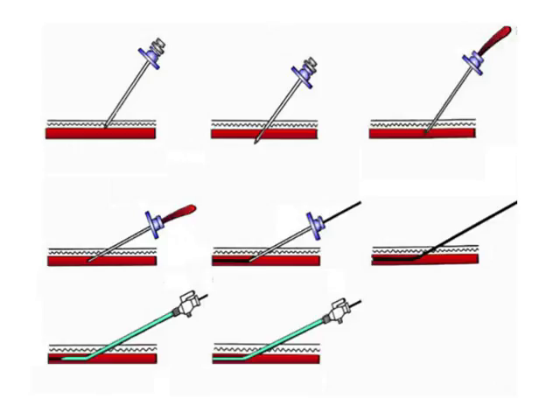There are 2 techniques for needle insertion: double versus single wall puncture. In double wall puncture, the needle is firmly inserted until the underlying bone is encountered. The needle is then depressed a few degrees, making a more acute angle with the patient's thigh. The needle is withdrawn slowly until brisk pulsatile backflow appears. Compression is needed to prevent hematoma of the other wall.